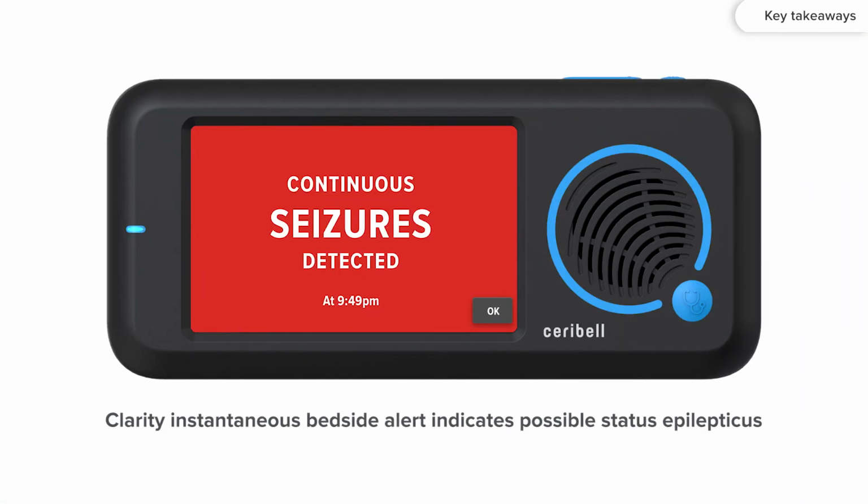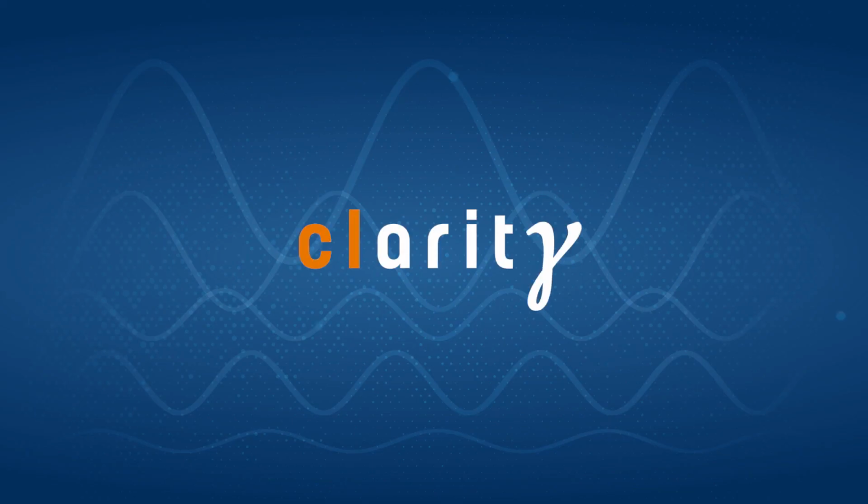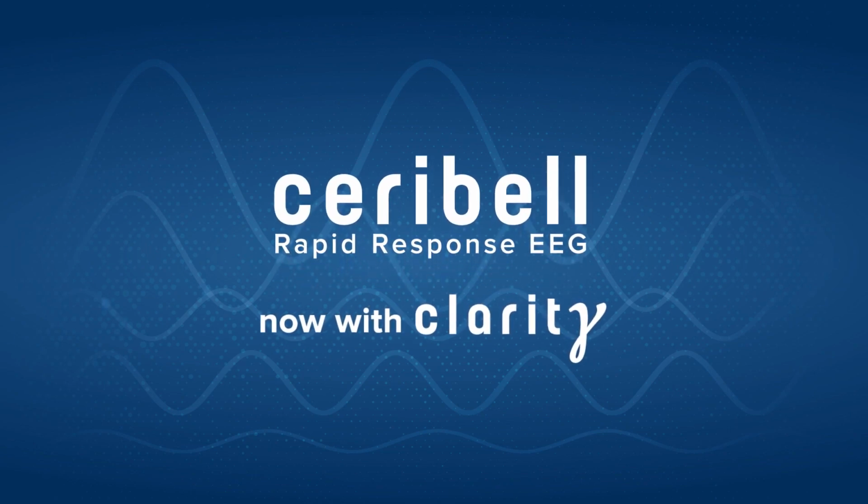A Clarity alert at the bedside is an indication that the patient may be experiencing continuous epileptiform brain activity or may be in status epilepticus. Use the Ceribell Rapid Response EEG with Clarity to make the best and fastest diagnosis for your patients.